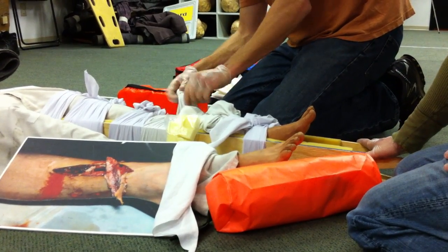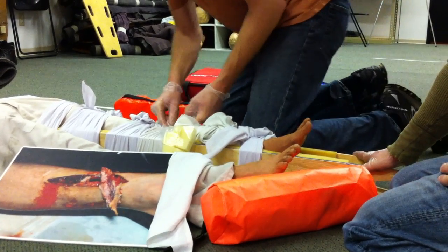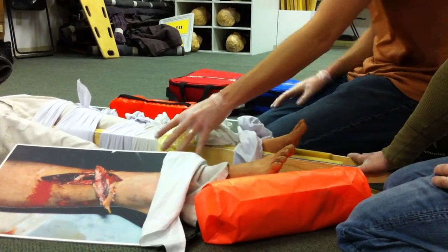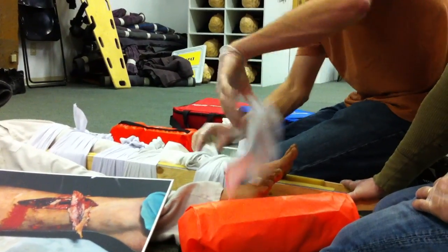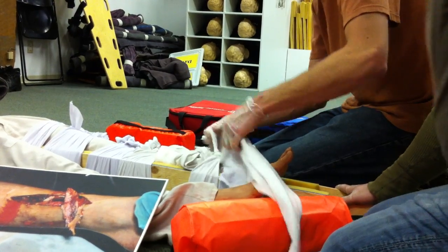You know, like that fellow that I had with the hand that was crushed, as soon as you get it all splinted, they tend to feel okay, things are okay. All right, so that's still on there. And then this one, you don't want it to cover over your knot for your loop tie, so you still have access to that injury.